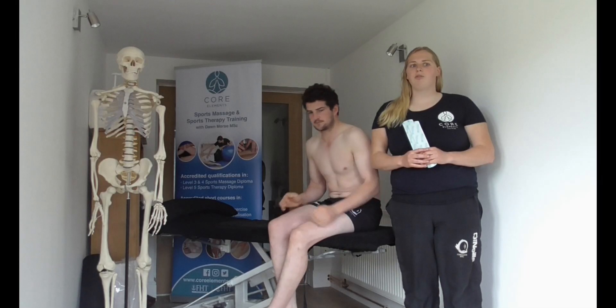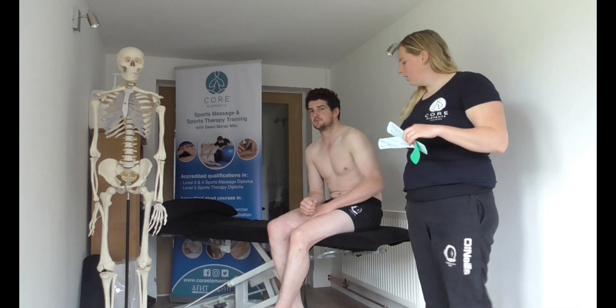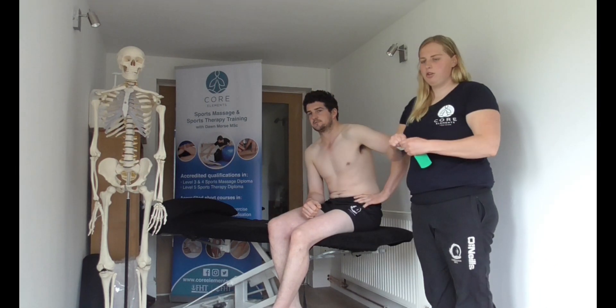In this video we're going to show you how to perform a mechanical correction for the AC joint or a humeral head depression. We're going to use two simple I-strips at 50 to 75 percent tension. Could you put your hand on your hip for us? Perfect. So we're going to get an inward and downward motion.